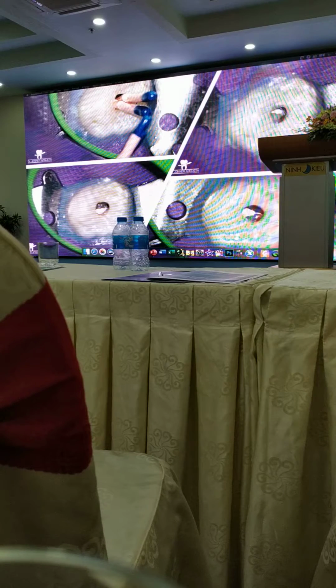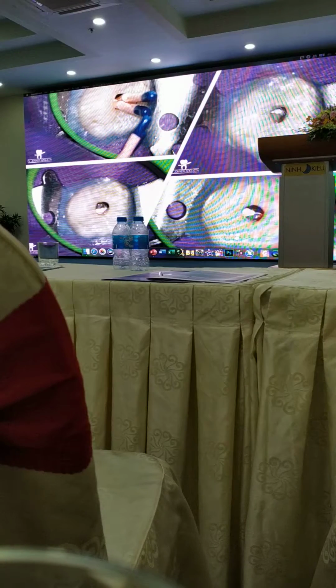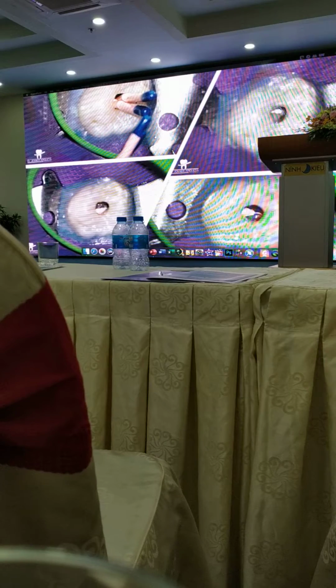For working in cases like this, you need to use rotary files in a martensitic stage. With regular nickel titanium, you will break the files because those files do not have enough resistance to cyclic fatigue.